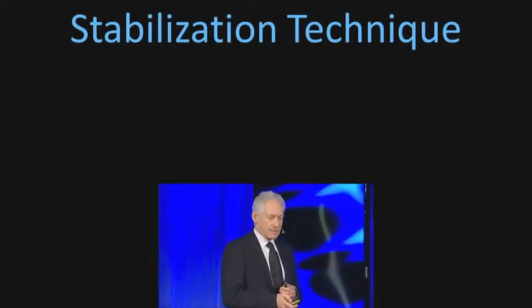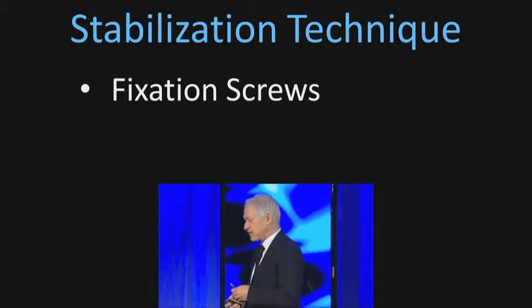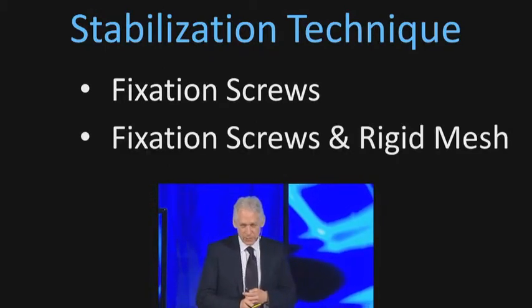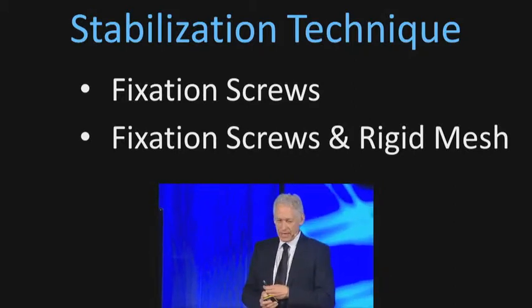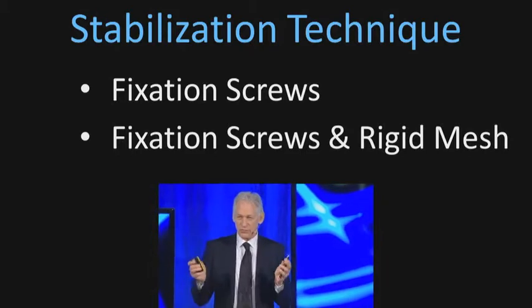Now, how do we stabilize it? We basically have two different directions. One will be the fixation screws, another one will be fixation screws and a rigid mesh, and I'm talking primarily on large ridge reconstruction.